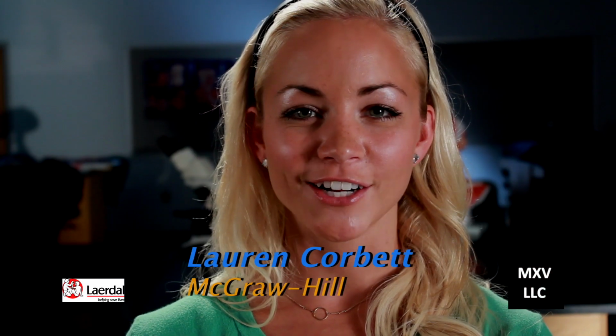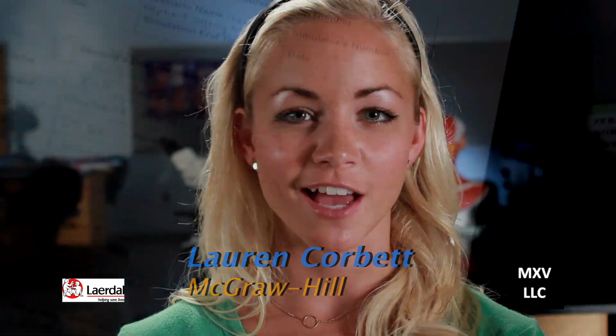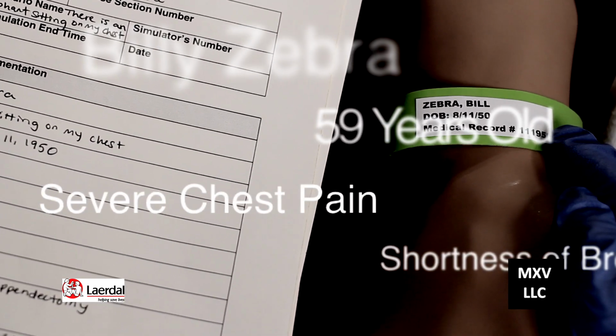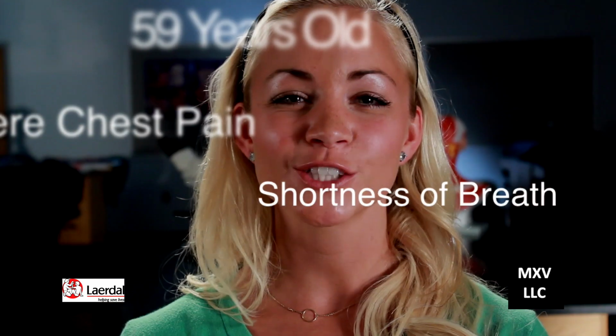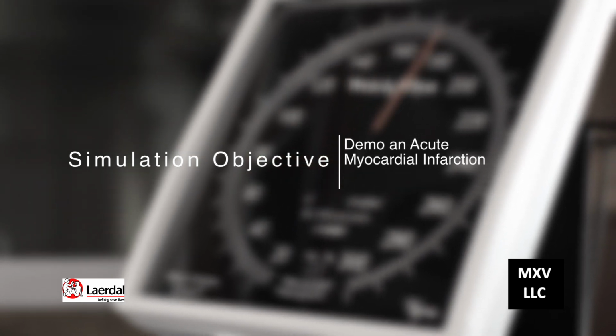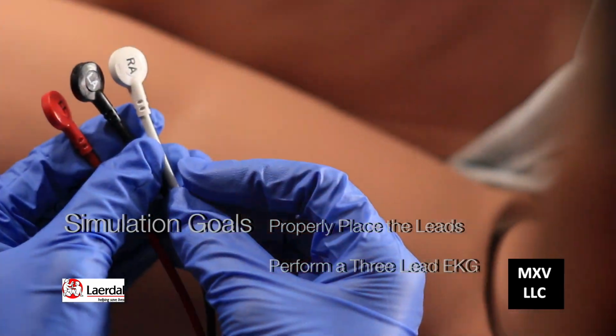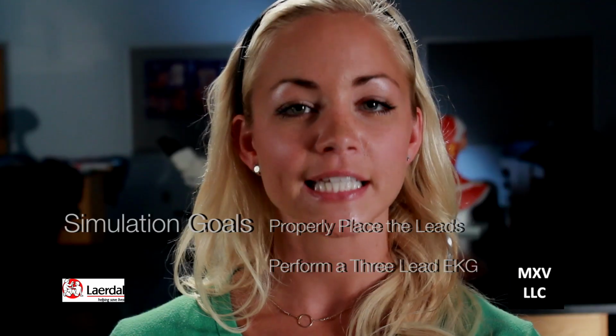Today we look at the scenario, there's an elephant sitting on my chest. Our patient is Billy Zebra, who is 59 years old. He complains of severe chest pain and shortness of breath. This simulation objective is to demonstrate an EKG showing an acute myocardial infarction. Your goals should include properly placing the leads and performing a 3-lead EKG.